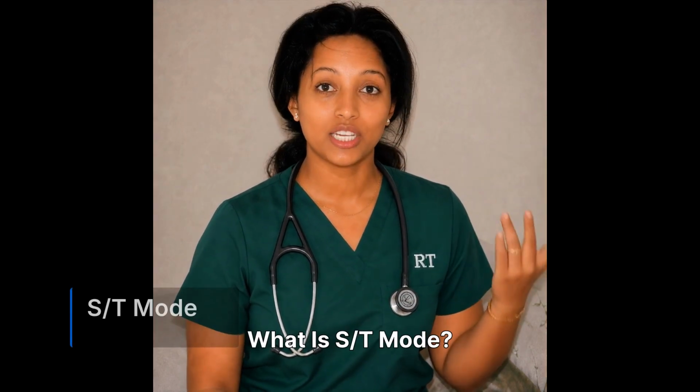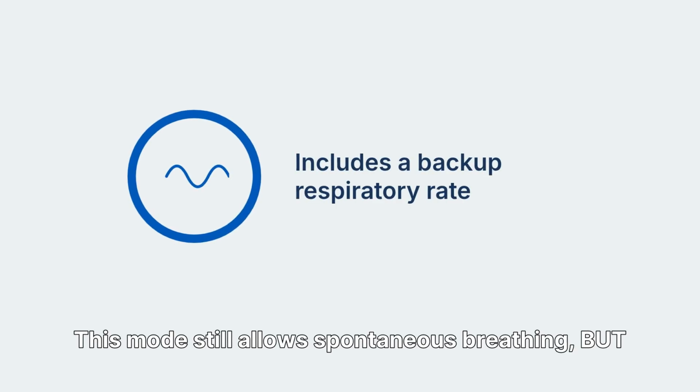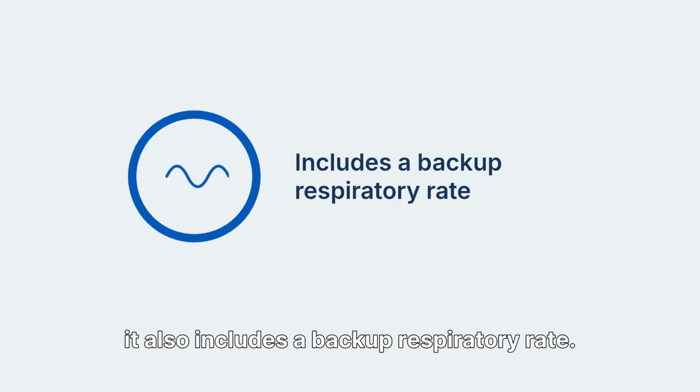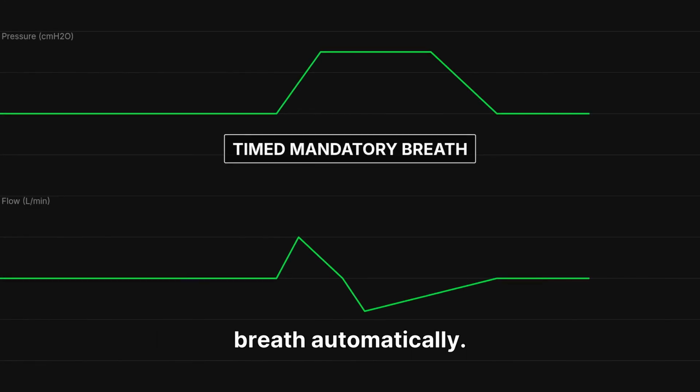What is S/T mode? S/T stands for spontaneous/timed. This mode still allows spontaneous breathing, but it also includes a backup respiratory rate. If the patient does not trigger a breath, the machine gives a timed mandatory breath automatically.